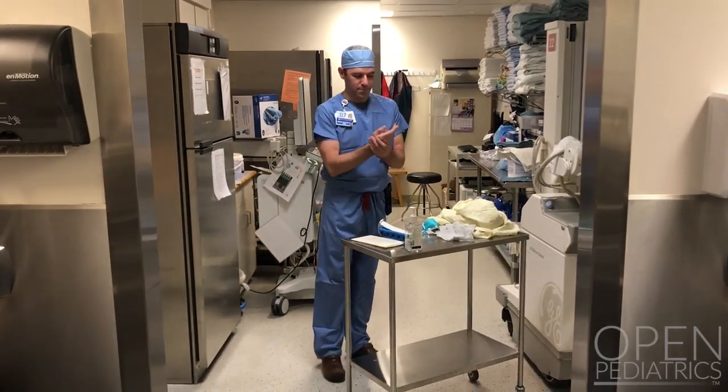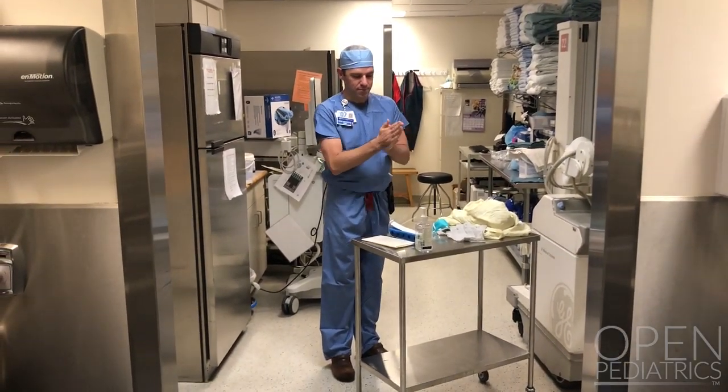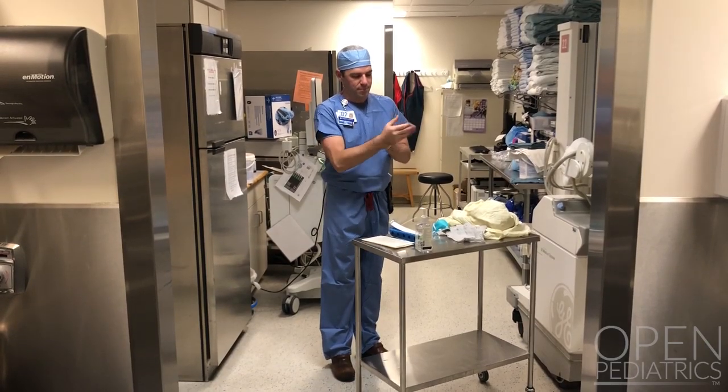First, perform hand hygiene. Let the alcohol rub dry on your hands.